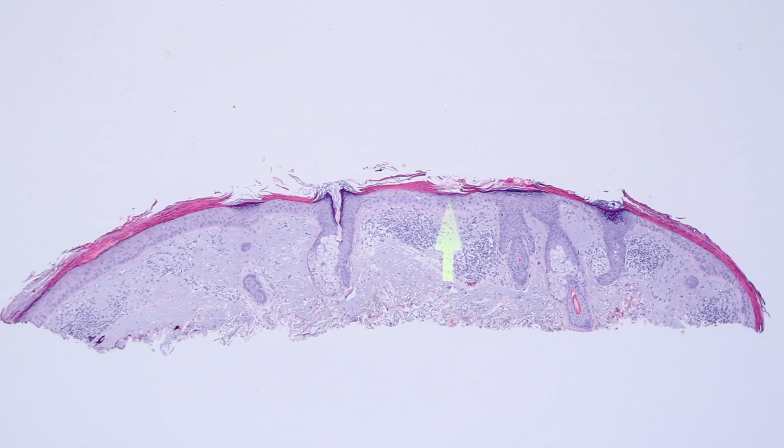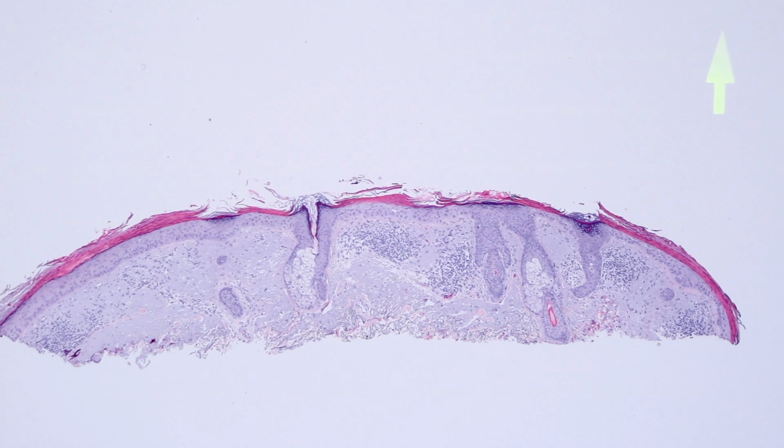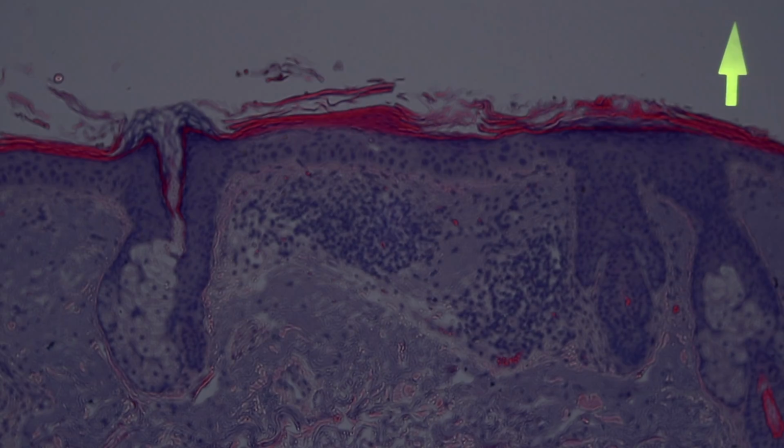And these lesions are dysplasia, they're precancerous, and again, they're due to chronic sun exposure. A small subset of them can progress into carcinoma. Most of them probably do not, but some of them can. And so they tend to get biopsied either if there's concern clinically that they might be cancerous, or if they've tried to treat the lesion with liquid nitrogen or something like that, and it's still persisted or recurred. All right, so the parakeratosis is a helpful feature.